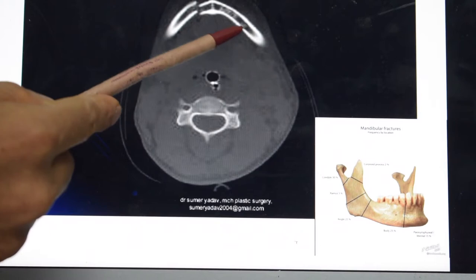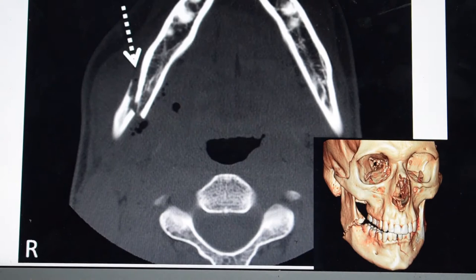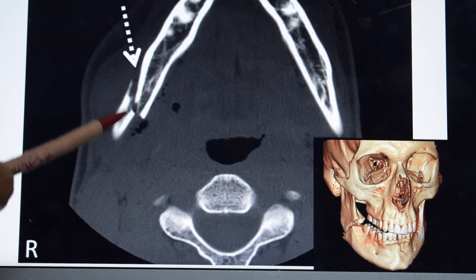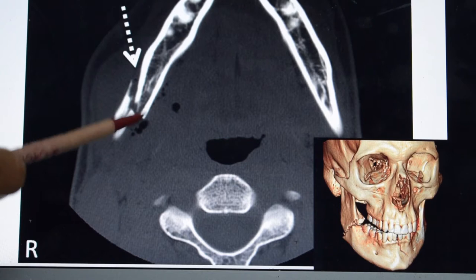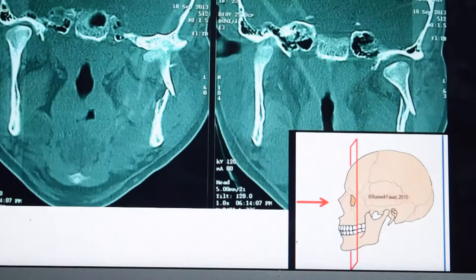The second most common facial bone fracture is the mandible, or jaw bone. You can see the discontinuity here — this is a fracture of the jaw at the body location. Here you can see two fractures in the jaw. If there is no fracture, you will see continuity of the jaw; here the continuity is disturbed, indicating a jaw fracture. If both cortices are disturbed it is a bicortical fracture; if only one side is disturbed it is a unicortical fracture. Here we have a bicortical or complex fracture.